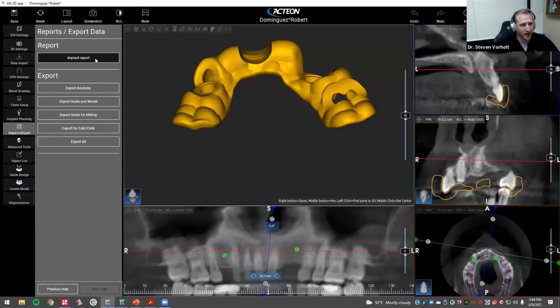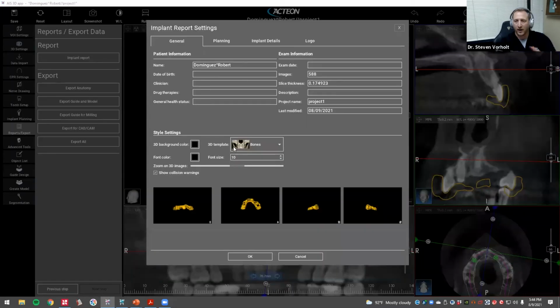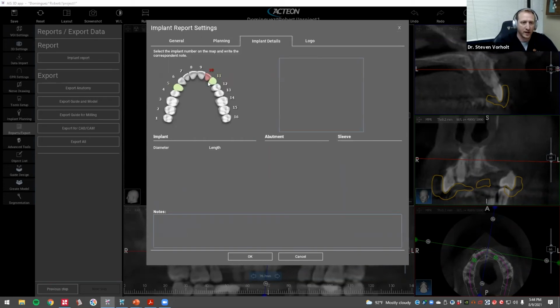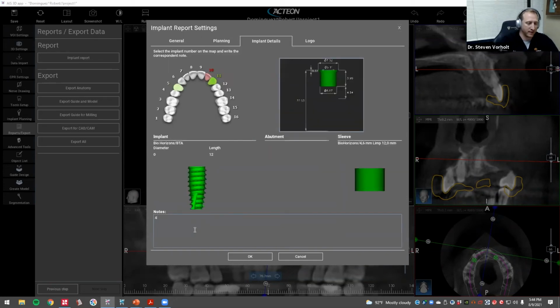I'm also going to have an option to make an implant report. This report will allow me to print off or create a PDF that I can load on the computer screen there. Then I can put all my little notes in here. I can say, patient is fantastic. Patient loves hard rock, I'm going to play that on the screen, whatever. And then here, I can type in, this is a 4.2 by 12 millimeter Tapered Pro implant. We're going to use 24 millimeter drills, SP3. I also have my nice schematic here to show me how long those drills are. So click OK, and it's going to export a PDF.